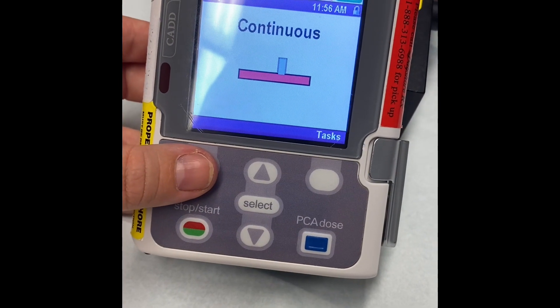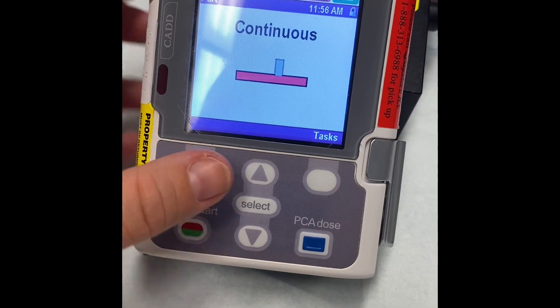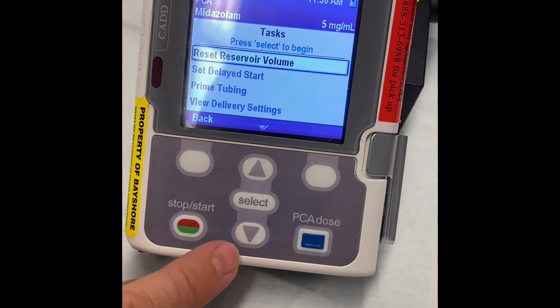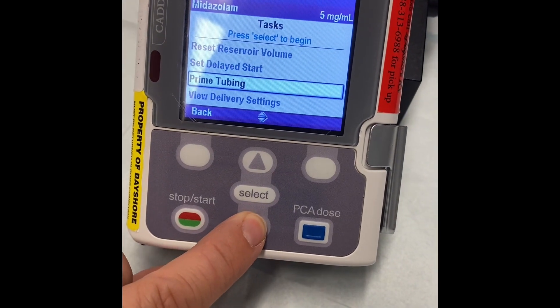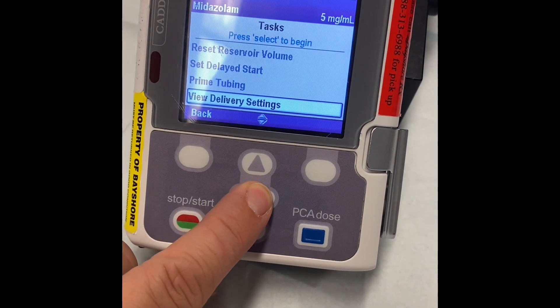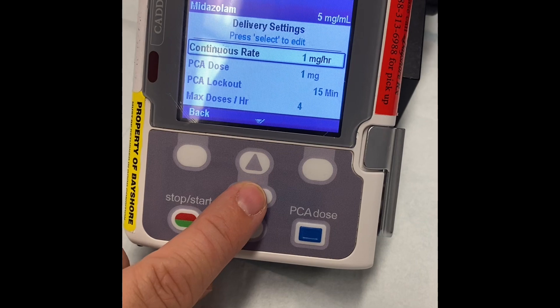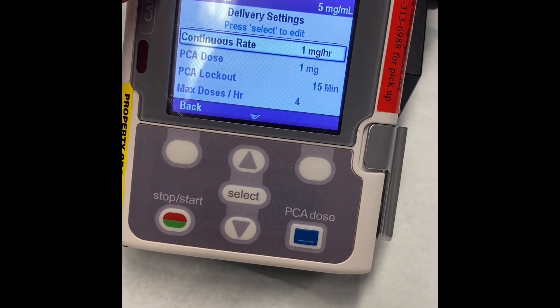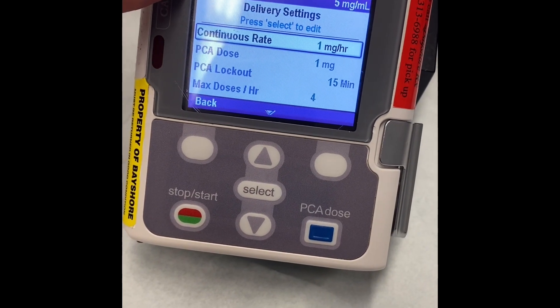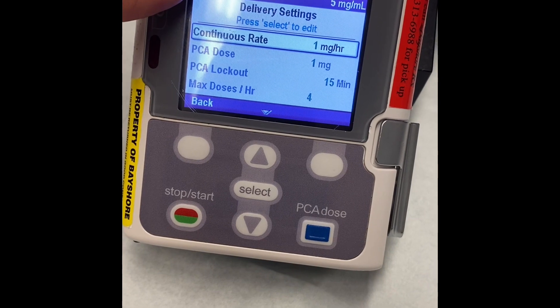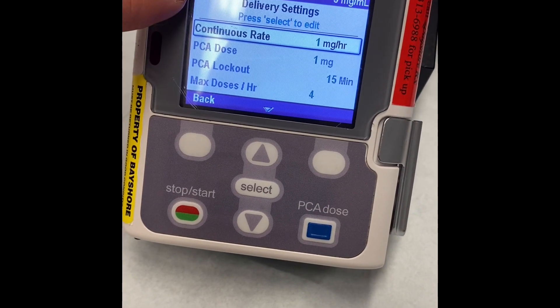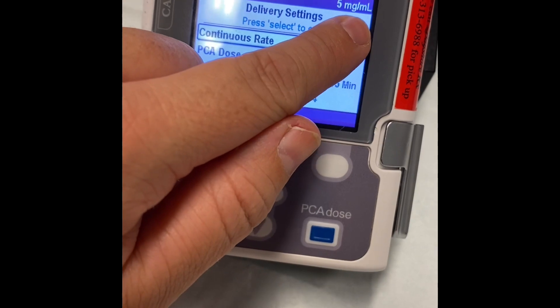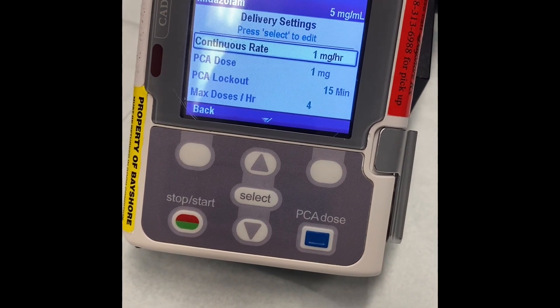Press any soft key to get back to the screen. We're going to go to select tasks, then down to view delivery settings. We can see here the PCA pump is set to PCA. The medication is midazolam and the concentration is 5 milligrams per milliliter.